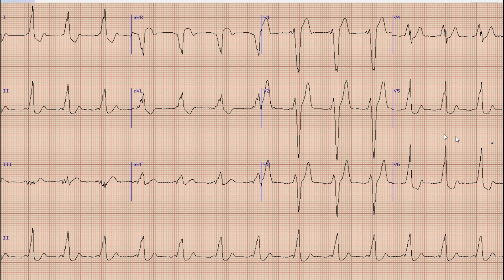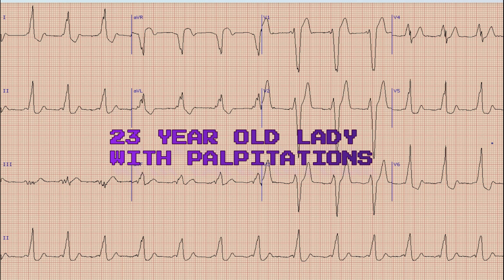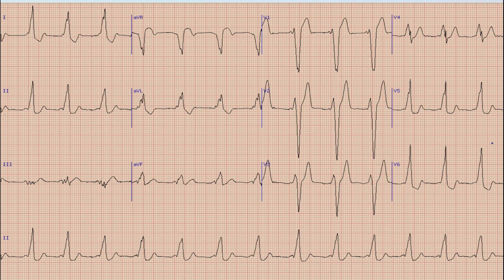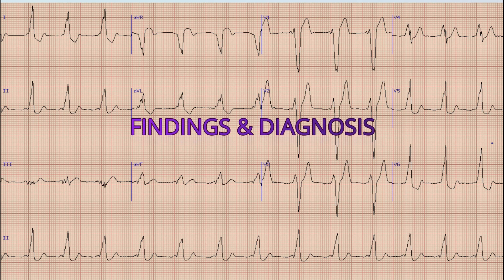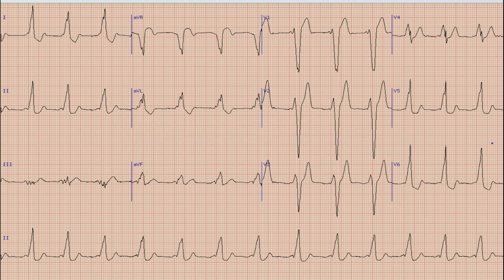This is the ECG which we are going to discuss today. Let me give you a brief history of the patient. This is the ECG of a 23-year-old lady who presented with a history of repeated episodes of palpitations. Before starting the discussion, pause your video, note down the findings and diagnosis, so that at the end of the video you can compare the discussion with your findings.